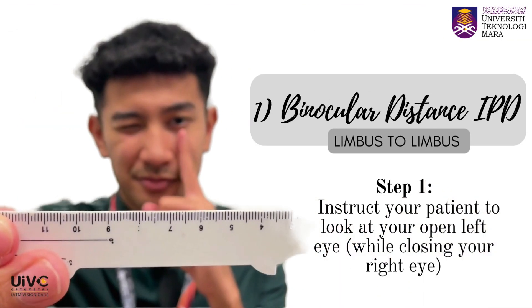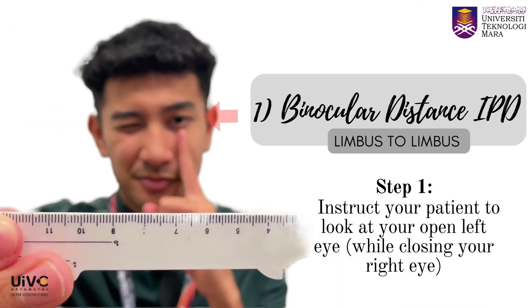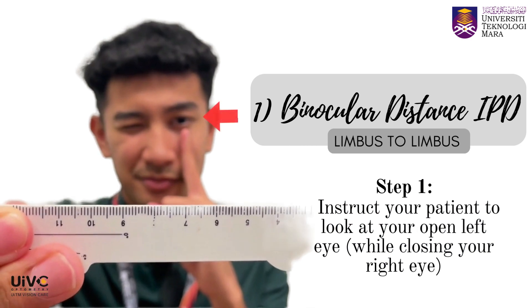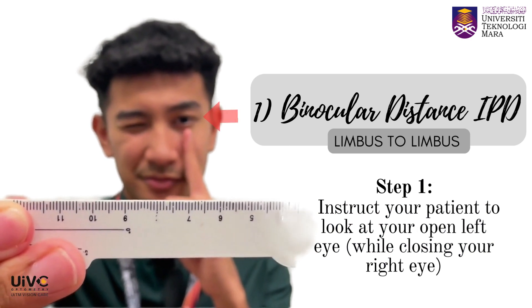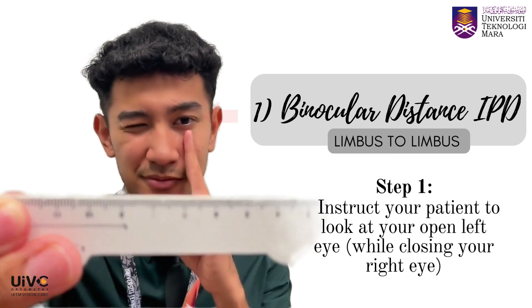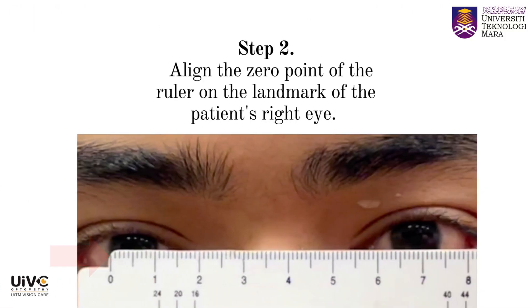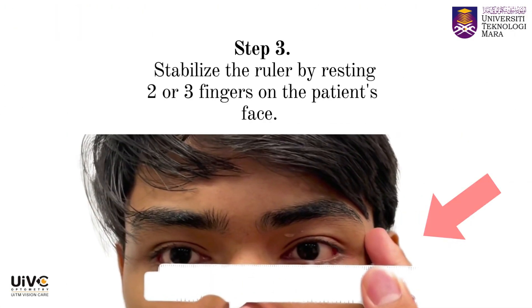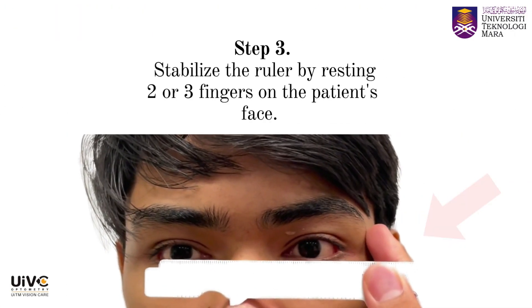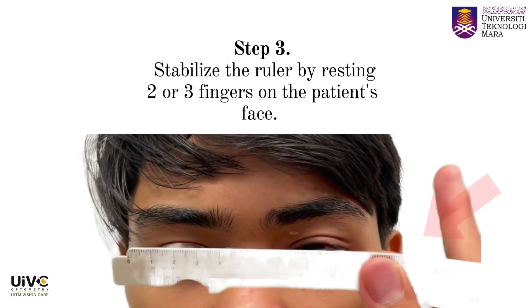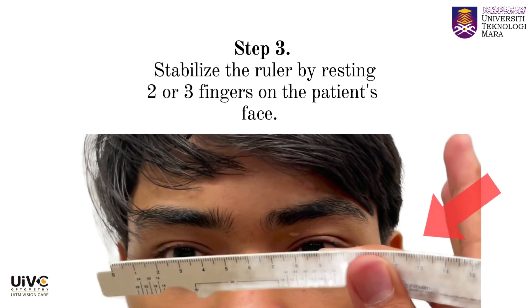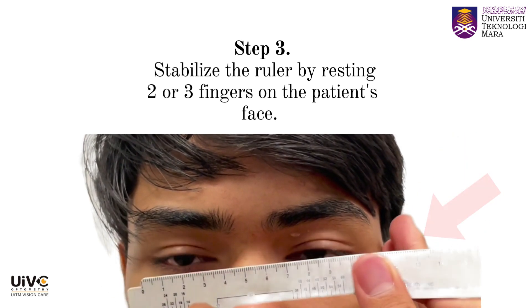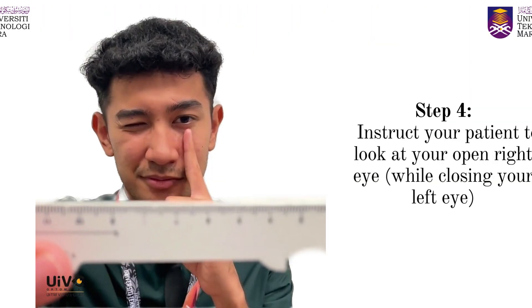Instruct the patient to look at your open left eye, then close your right eye. Align the zero point of the ruler on a landmark of the patient's right eye. Stabilize the ruler by resting two or three fingers on the patient's face.